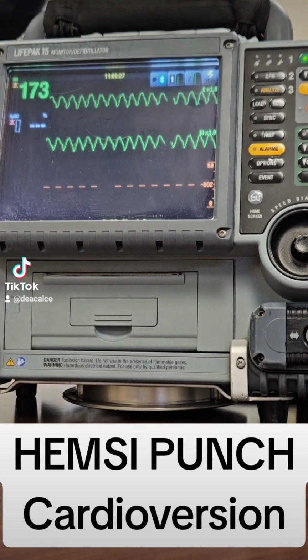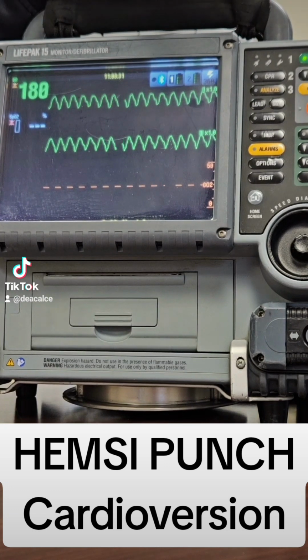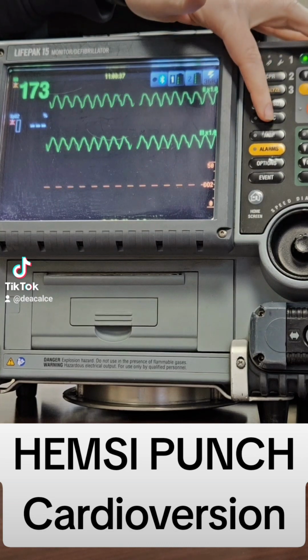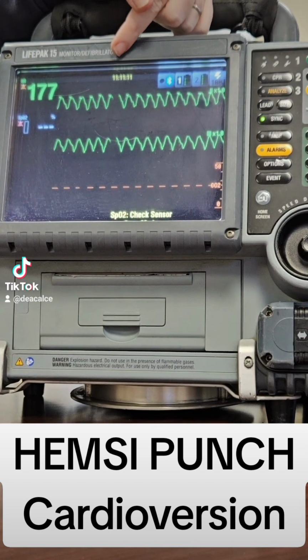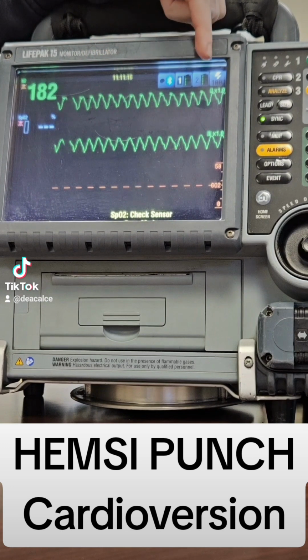So when you have your patient on the monitor and you have your patient's pads on, and that'll be anteriorly and posteriorly, we're going to make sure that we see the rhythm, and the first thing we're going to do with a pulse, we're going to verify they have a pulse, and then we're going to hit sync. So after we've hit the sync button, we want to make sure that we are truly synchronized with this patient's rhythm by the indication arrow at the top of every QRS.